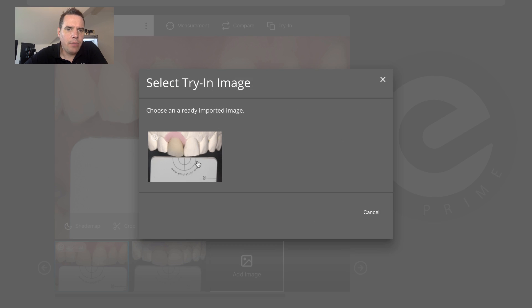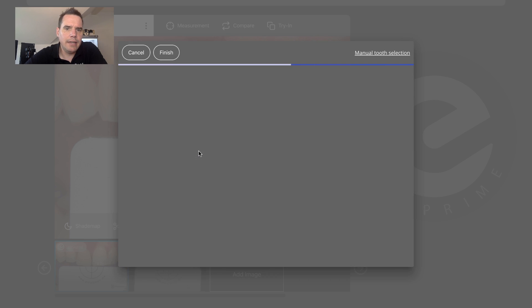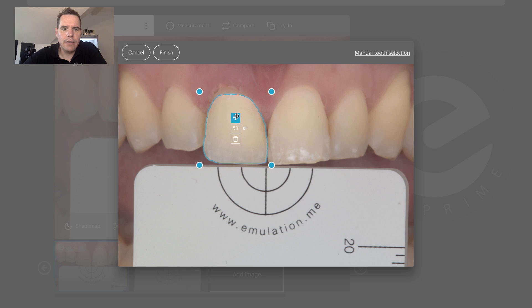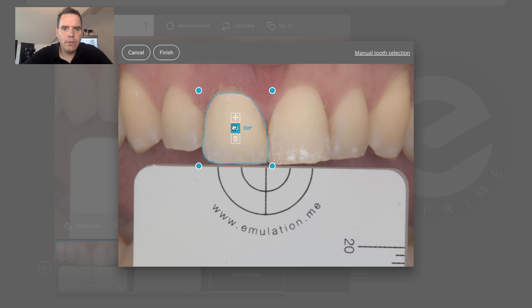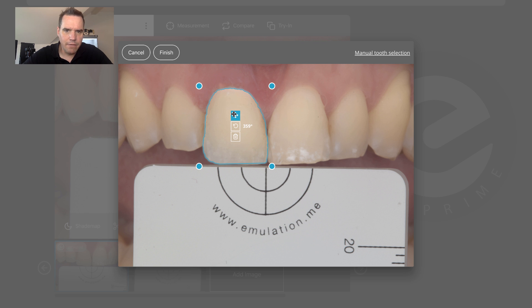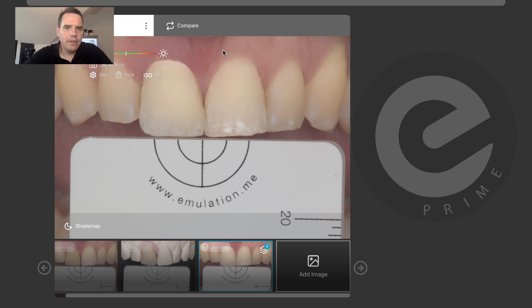This is the image that pops up, which is the model image — notice that this has been photographed on the simulation model. We're going to post a video very soon on the simulation model: what it is, how it works, and how to make one. But you can already find some more information on this on our webpage. You select it and Prime is going to isolate the crown. Now you can move that crown around, change its size, rotate it if you want. The idea is to match it as closely as possible into this image so that you can measure color, compare the difference, and also get a visual impression of how this could look in the mouth. When you're happy with this, you click on finish and here is your digital try-in.